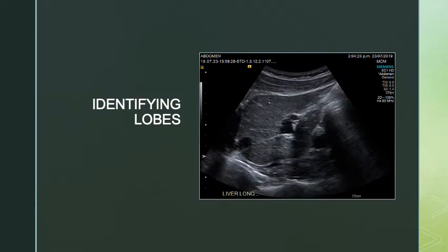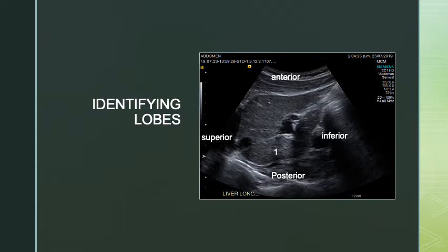Next, let's look at a longitudinal image of the left lobe of the liver, with superior, inferior, anterior, and posterior orientation. You can see the left portal vein, the ligamentum venosum, and the left hepatic vein. Here I have segment one — the caudate lobe — segment two, and segment three. Segment two is my superior lateral, and I can estimate that four A is separated from two by the left hepatic vein. Segment three is the inferior portion of that lateral lobe.